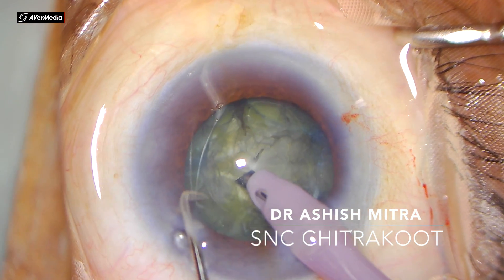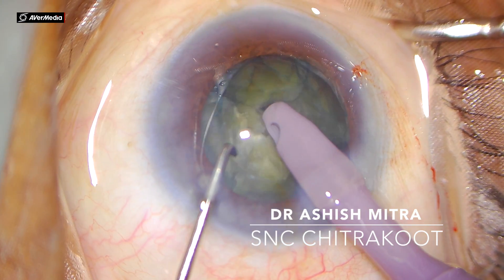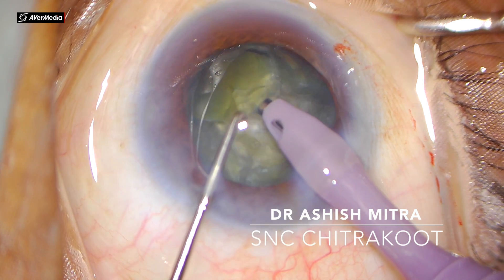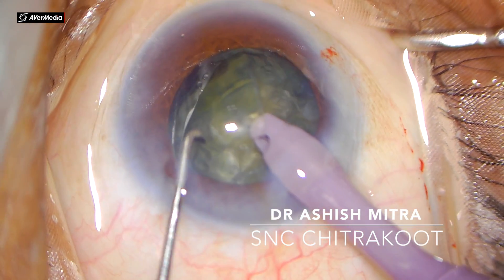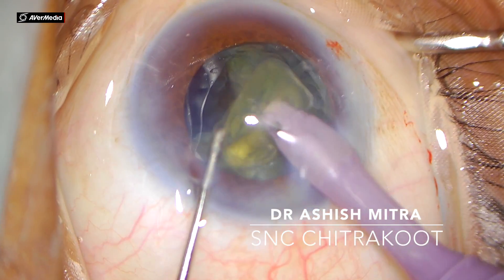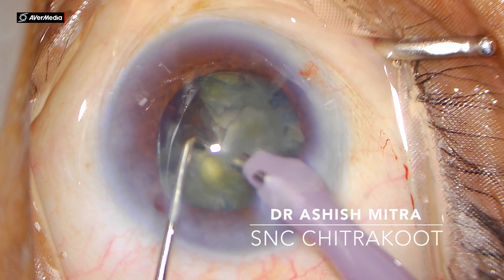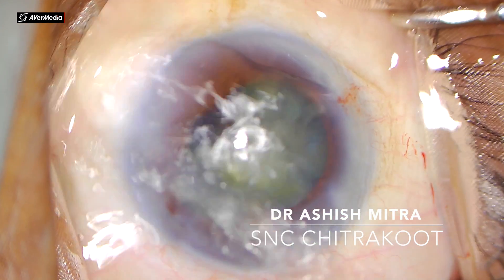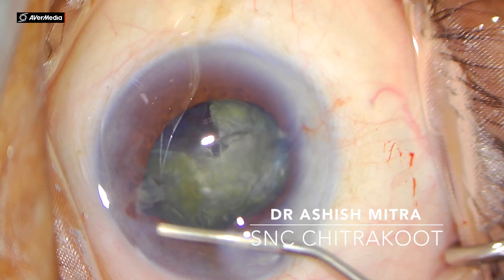For grade 2 to 3 cataracts they are good enough to hold and require very little power to get emulsified. One of the pieces was lifted up; since it was a big piece I tried to chop, but since it is a soft cataract you can watch that I will emulsify using the phaco probe. The role of the chopper was very limited and the energy delivered was very low.